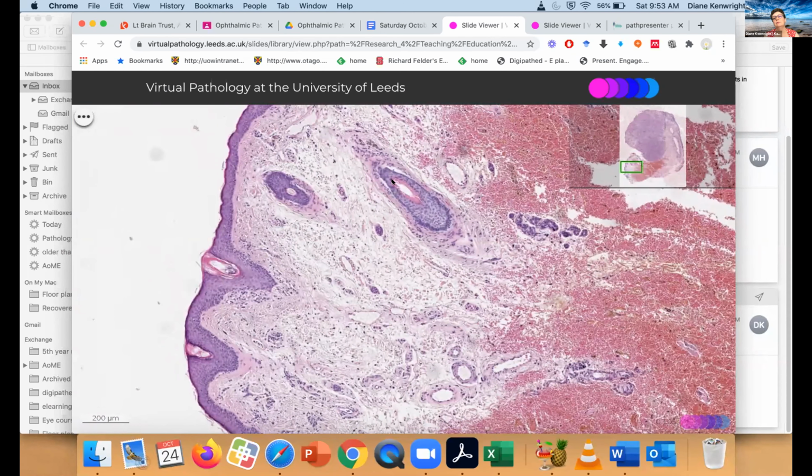I would mention that I couldn't see any perineural or vascular invasion. I would mention that the margins were clear. It appears to be non-ulcerated. Was there anything else that you would mention in prognostic features, Amanda? Mainly the Breslow depth is the most important one.